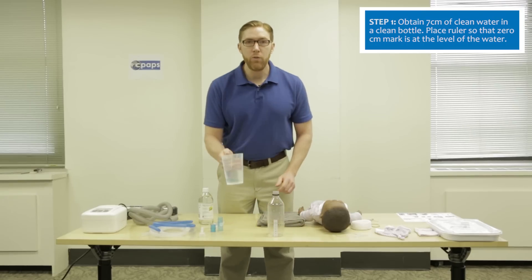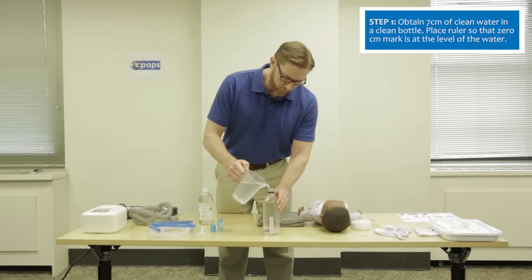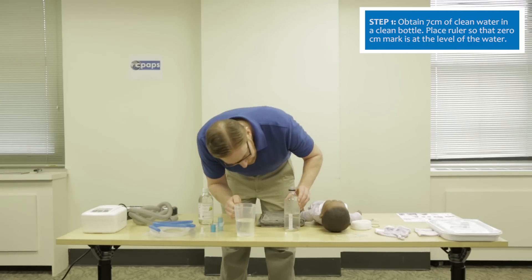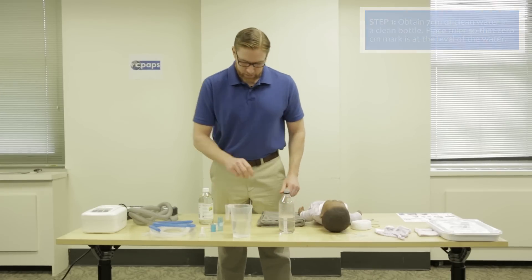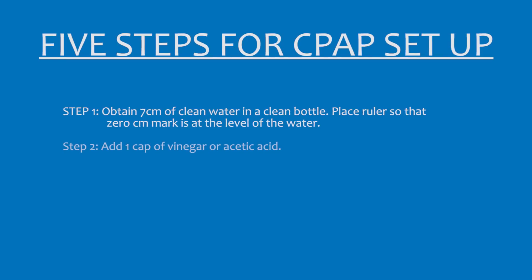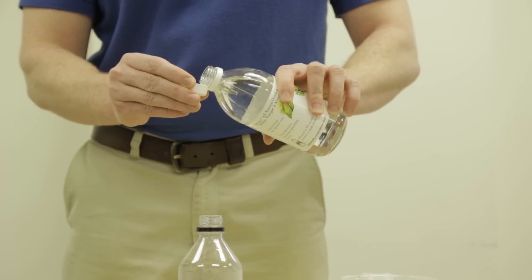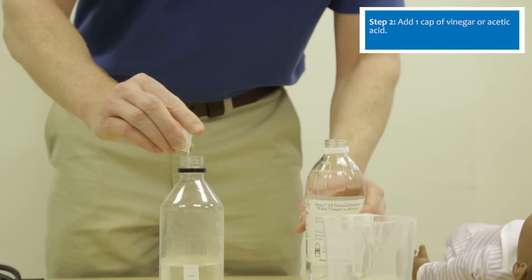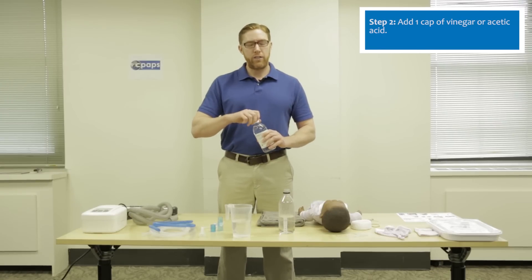Take clean water and apply 7 centimeters of water into the clean water bottle. Then take a bottle of vinegar or 5% acetic acid and place one cap full of vinegar into the water. This makes the water bottle bacteriostatic and mycobacteriostatic.